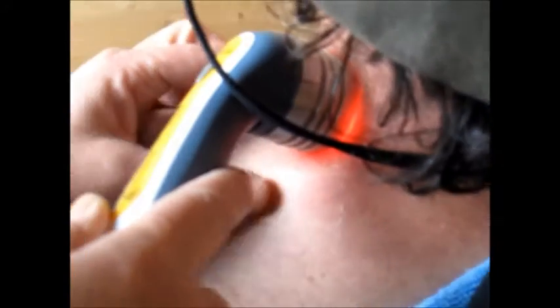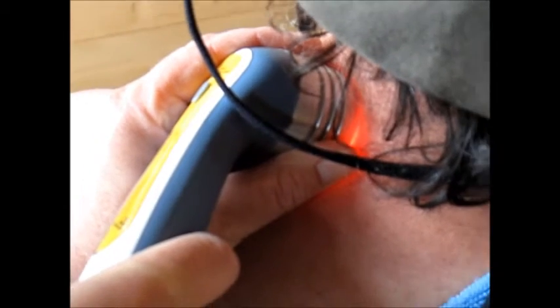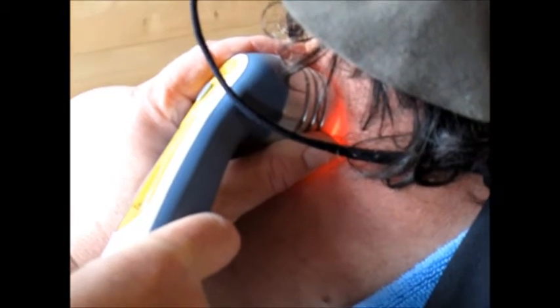If I'm doing an area like this on the neck where it could cross over, I'll just put my hands like this just to make sure that the patient's not in danger of having his eyes in contact with any of the laser.